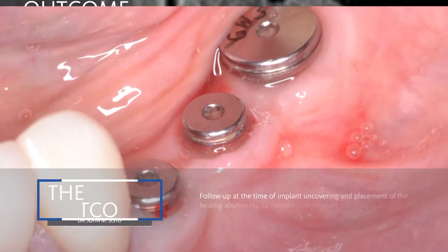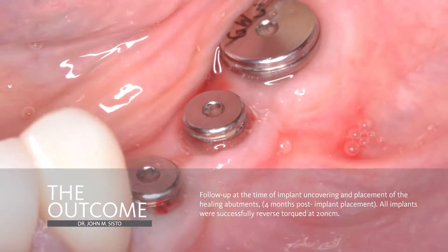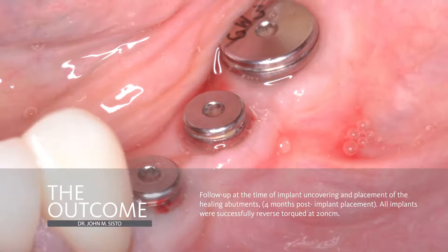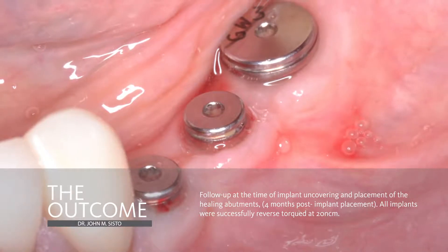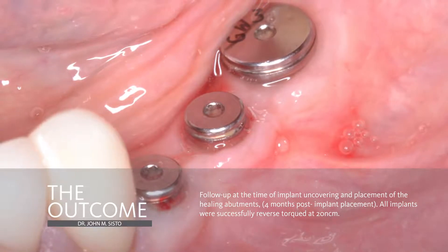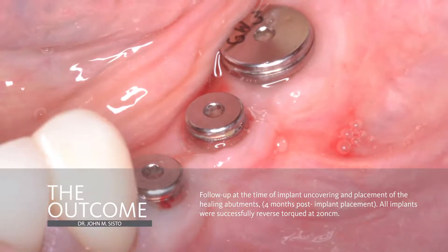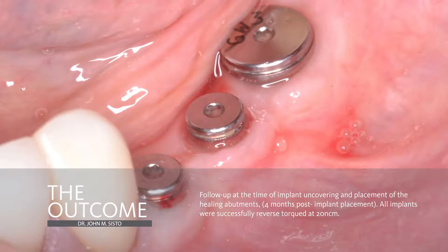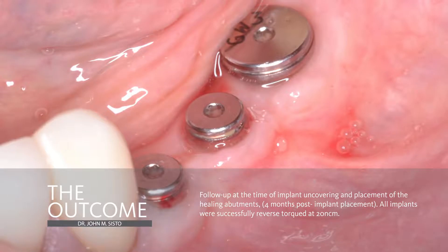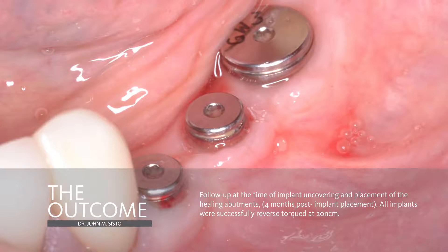Successful healing is seen at four months. At this time, all three implants were reverse torqued at 20 newton-centimeters with no movement. One can see that these healing abutments are surrounded by thick keratinized tissue. This combination of good tissue and excellent bone helps to prevent any future bone loss and longevity of the implants.